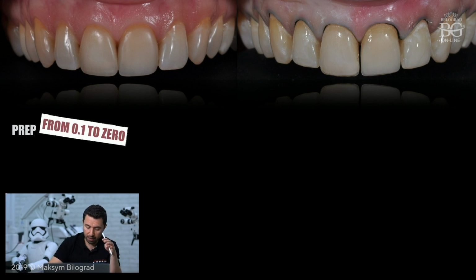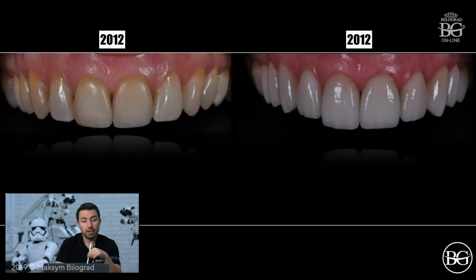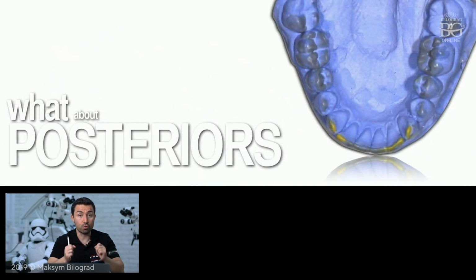So this is before and after preparation, and here we have the final result straight the same year. As for posterior teeth, because I mentioned that we had to increase vertical dimension in this particular case, analyzing cast models and wax-up, we came to the conclusion that we should just add a little bit of material on the occlusal surface. And since teeth are intact, I was not comfortable prepping these teeth for overlays or occlusal veneers. So I decided to go for transitional bonding, actually the copy-paste technique.